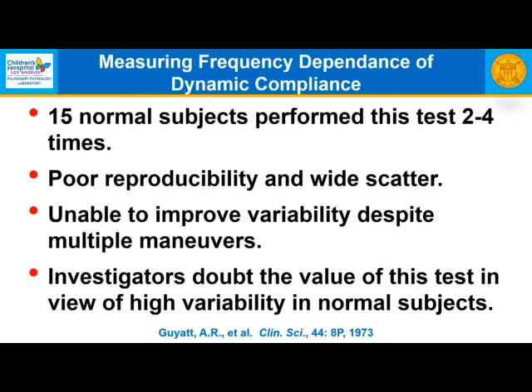Now the problem is that these particular investigators performed this test 2 to 4 times on 15 normal subjects. They found poor reproducibility and wide scatter. They were unable to improve variability despite multiple maneuvers, and these investigators doubt the value of this test in view of the high variability in normal subjects.